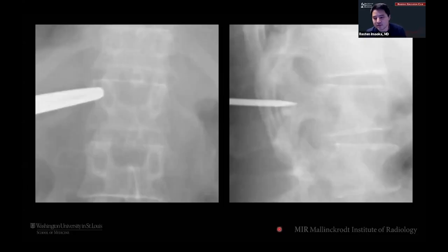So as maybe you guys have seen already when you're doing these types of procedures, whether or not you're doing biopsies or kyphoplasties, we'll start out with your fluoroscopy like this, and we're always going to be starting on the lateral aspect of the pedicle, right? The most important part where you potentially are going to get into trouble when you're doing these types of procedures is violating that medial wall of the pedicle cortex. So we'll always mark that upper outer side of the pedicle.